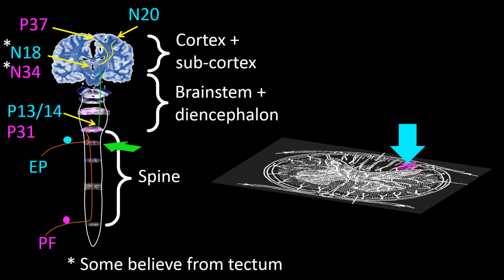At the level of the spine, normal posterior tibial somatosensory evoked potential and abnormal upper extremity evoked potential suggest, at least theoretically, a cuneatus fascicle or nuclear lesion and sparing of the gracilis fascicle and nucleus. This is only so if a cortical lesion or an upper extremity peripheral nervous system lesion can be ruled out and the possibility of artifacts eliminated.